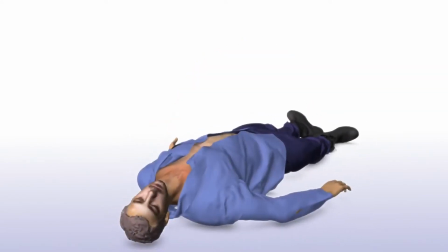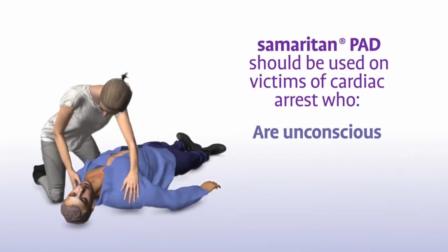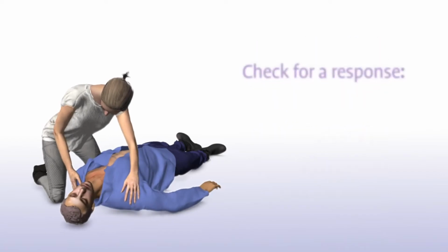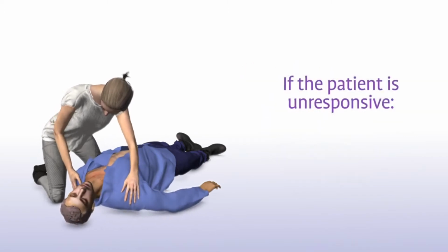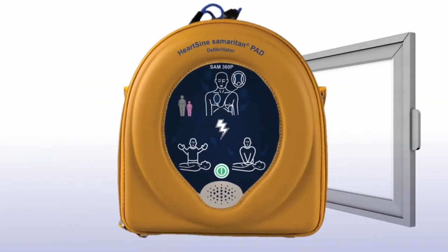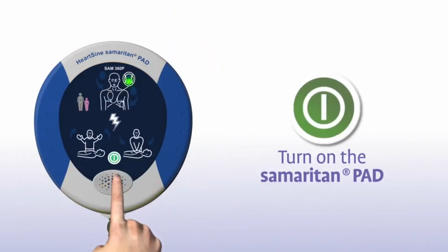The Samaritan PAD should be used on victims of sudden cardiac arrest who are unconscious, not breathing. Check for a response by shaking the victim by the shoulders and talking loudly to the victim. If the patient is unresponsive, immediately call for medical assistance and get the Samaritan PAD as quickly as possible. Press the green on-off button to turn on the Samaritan PAD.